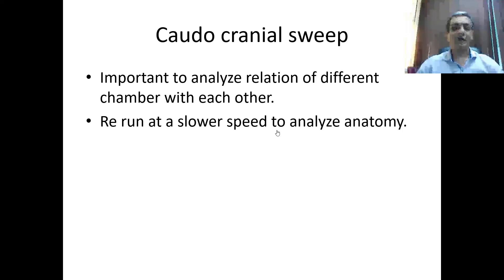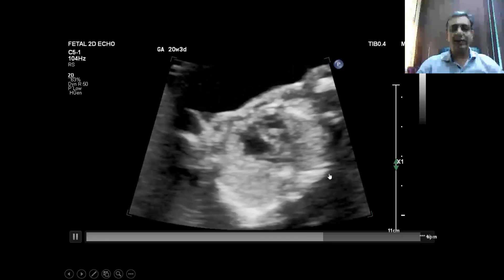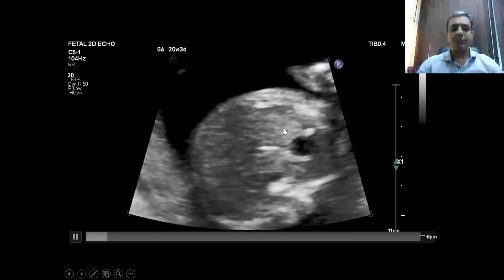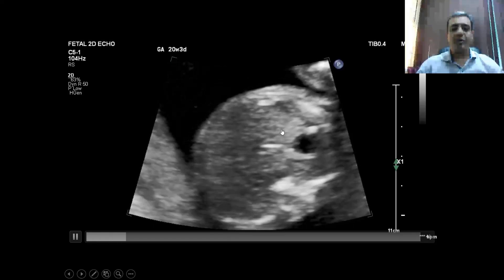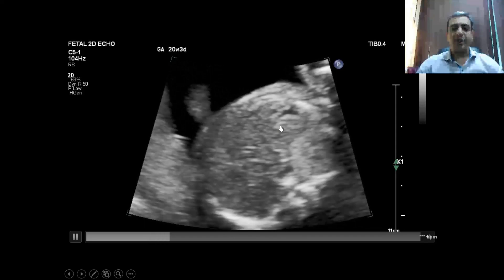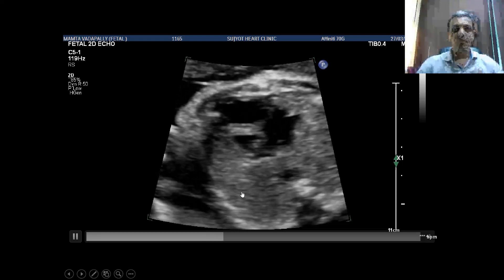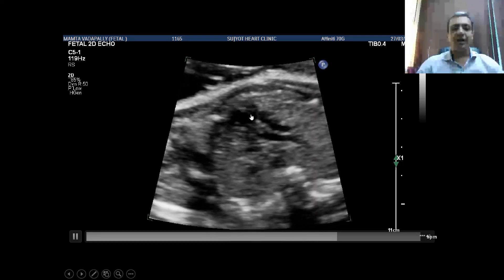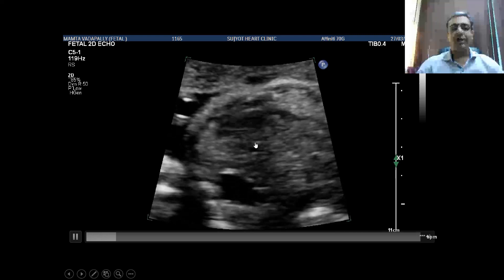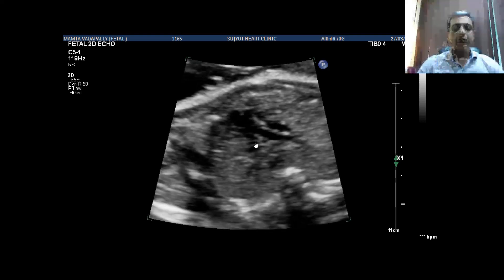The cordo-cranial sweep is an important technique that should be performed in every fetal echo. Reassess the sweep at a very slow rate to understand the anatomy. In this case, sweeping from the subcostal view shows the small left ventricle with endocardial fibroelastosis, and finally the main pulmonary artery — the aortic arch cannot be well appreciated on 2D. Another cordo-cranial sweep shows a dominant right ventricle and small left ventricle; again, the aortic arch is not appreciated on 2D and could only be seen on color Doppler.